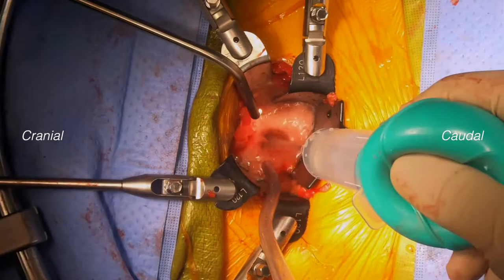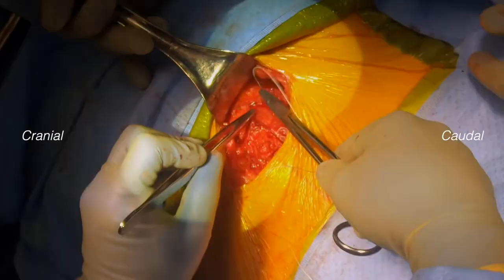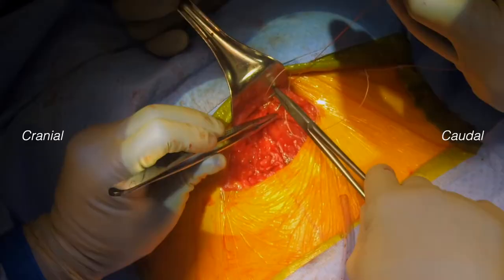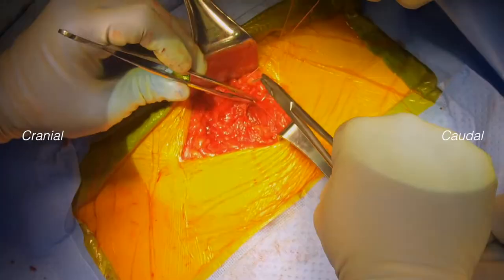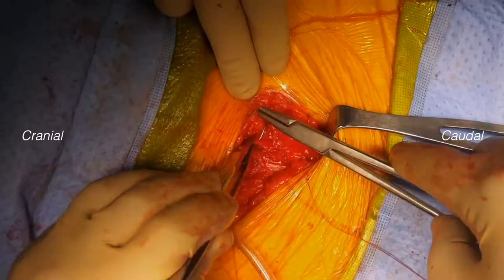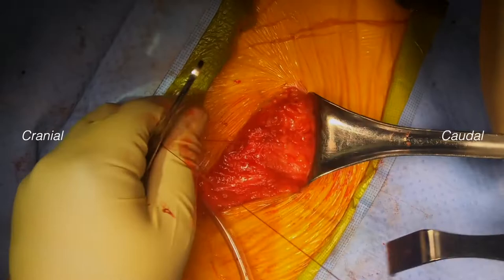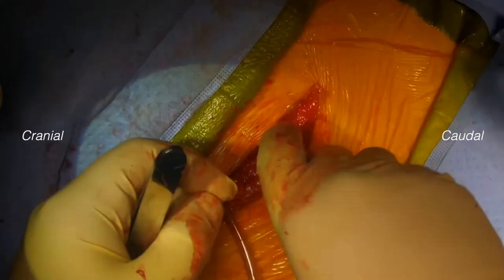After final AP and lateral fluoro views, we sequentially remove our retractor blades and examine the vessels to be sure there is no ongoing bleeding. We close the anterior rectus sheath with a running locking Vicryl stitch, edge to edge rather than infolding. The sub-Q is closed with two Vicryl buried stitches and the skin is closed with a subcuticular Vicryl stitch followed by dermabonding. We use an abdominal binder post-op and mobilize the patient the same afternoon.